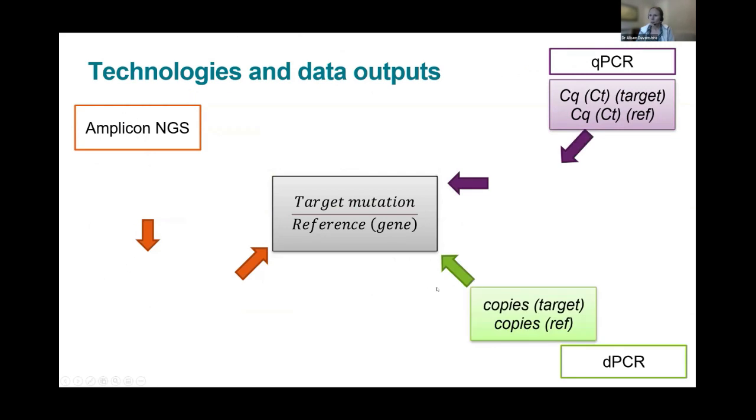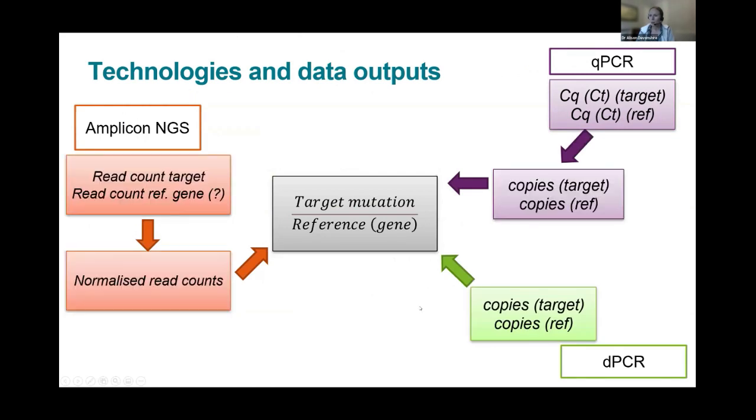As well, we have a variety of techniques being used for measuring this quantity, which is central to MRD monitoring, that of the target mutation, which is normally normalized to a reference gene or potentially some other reference.